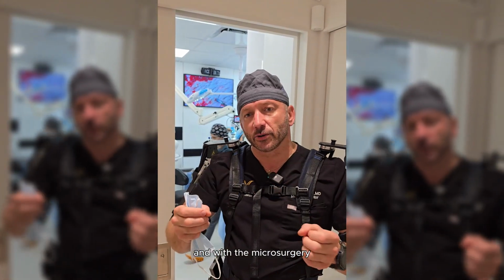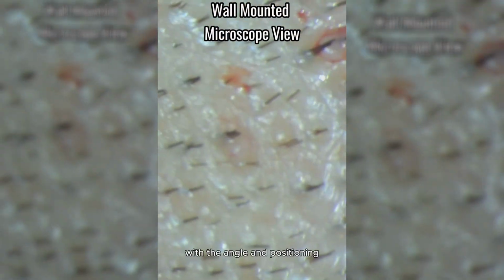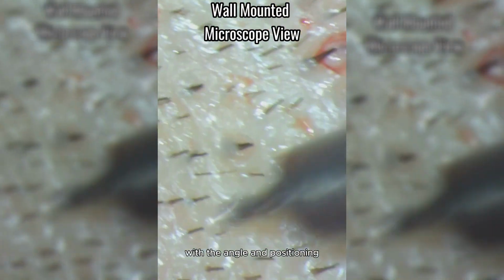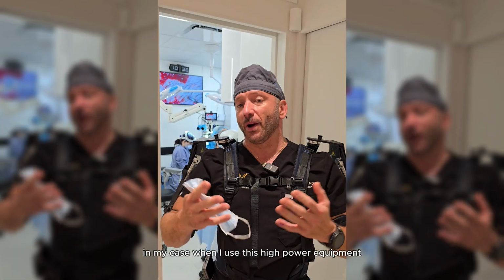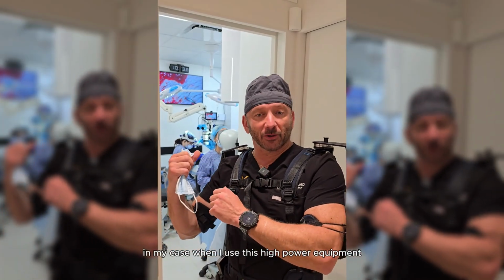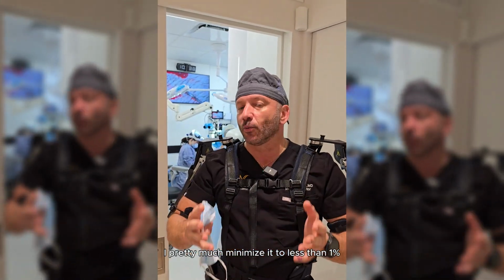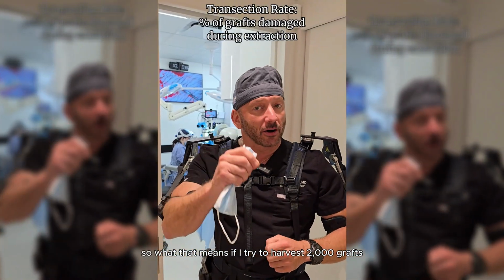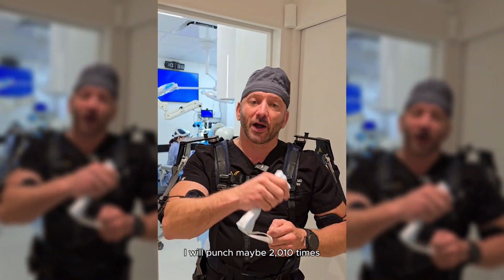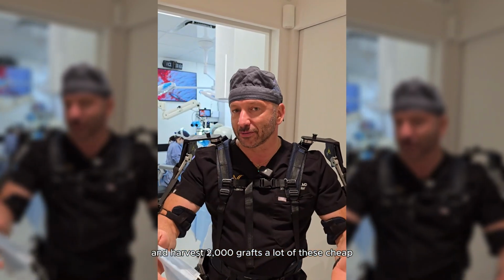And with microsurgery, you have to be very precise, down to a fraction of a millimeter, with the angle and positioning the punch around the hair shaft. In my case, when I use this high power equipment versus regular loupes, I pretty much minimize the transection rate to less than 1%. So what that means is, if I try to harvest 2,000 grafts, I will punch maybe 2,010 times and harvest 2,000 grafts.